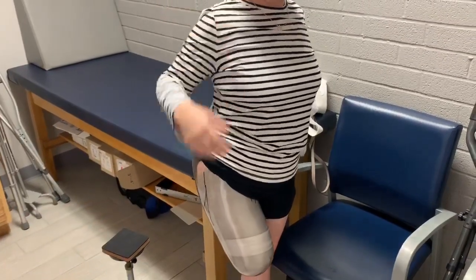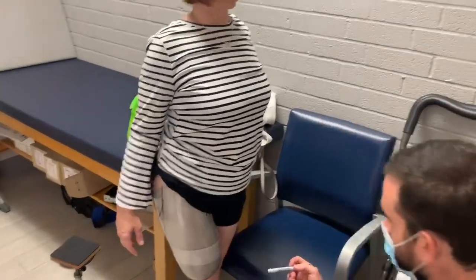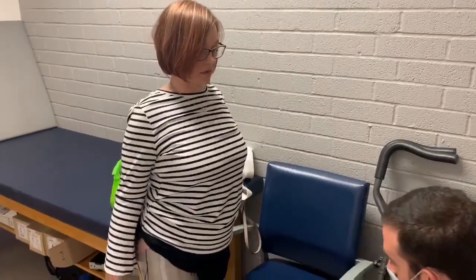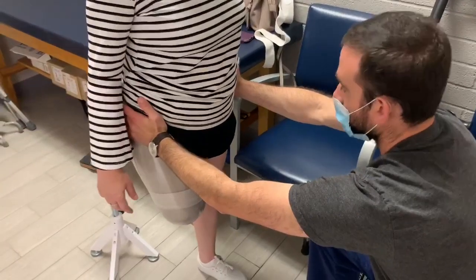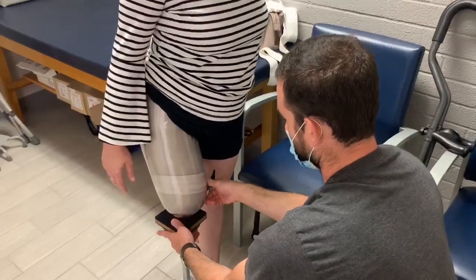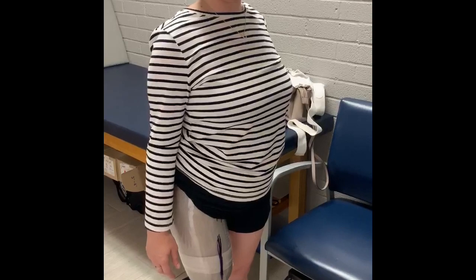And drop that on for me. And just look straight ahead again. Now this is going to be weird because you've got all your weight just on this foot. Hold the table for me. Actually, lift up for me. Now back down. There we go. It's a little high, but that's okay. A little bit out and set.